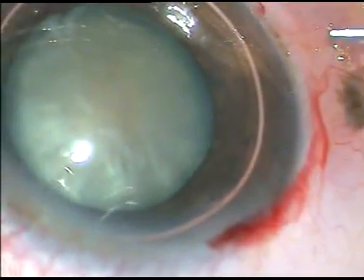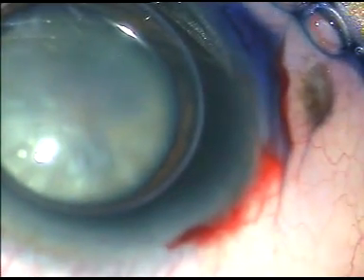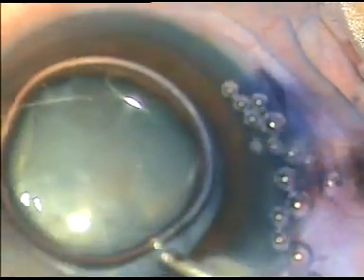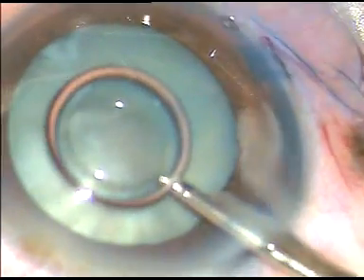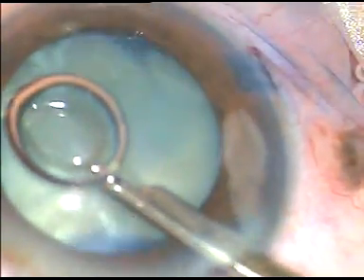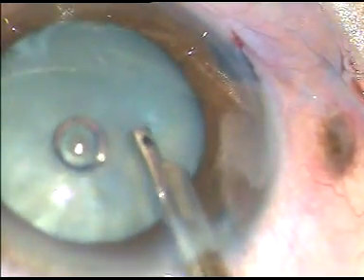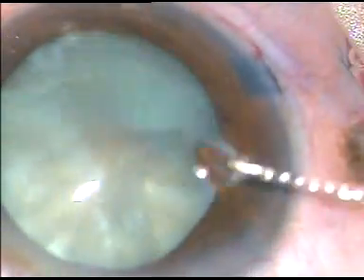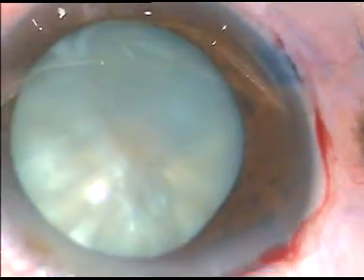We can see this is a white cataract and it appears like an intumescent cataract. By this time, the main incision and a side port has been made on the right side. The anterior capsule has been stained with trypan blue dye, which is now being washed out. As we touch the anterior capsule, you can see that the cortex gets displaced.